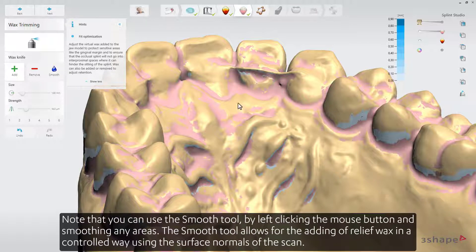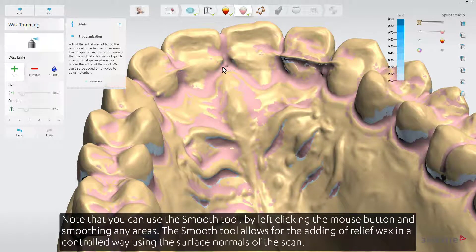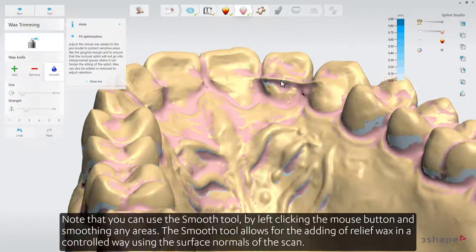Note that you can use the Smooth tool by left-clicking the mouse button and smoothing any areas. The Smooth tool allows for the adding of relief wax in a controlled way, using the surface normals of the scan.